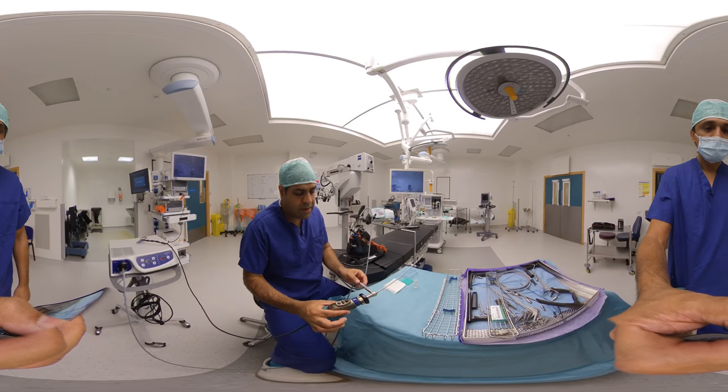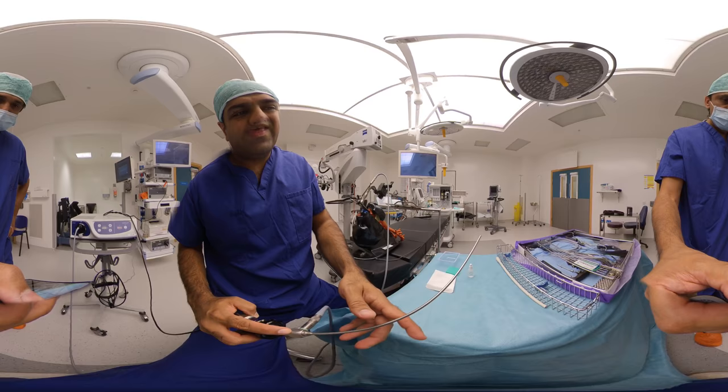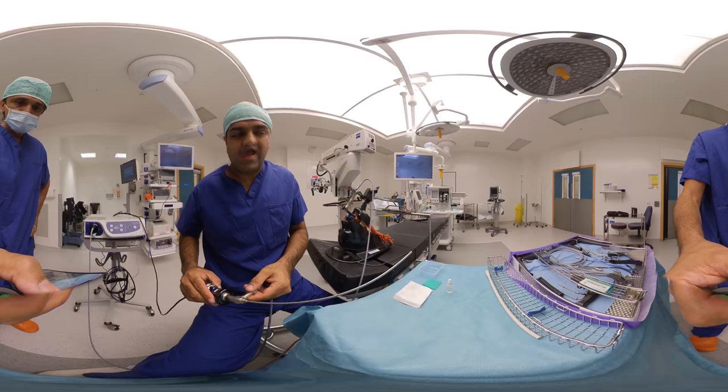We're now going to talk about our endoscope. This is a zero degree scope — you can see it's a zero degree scope on here, and the end is also flat. If this is a 30 degree scope, it would be beveled, or a 70 degree scope, allowing you to have a look at the subglottis or the ventricle more easily.